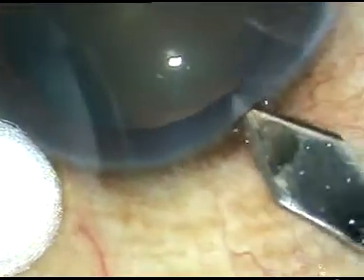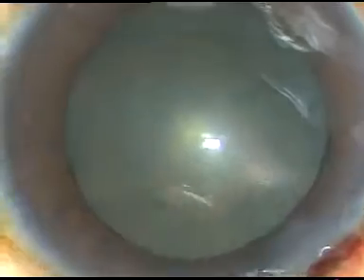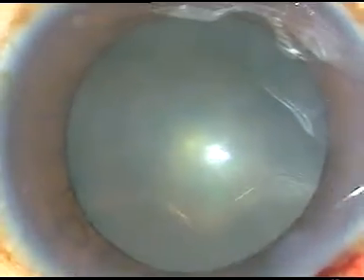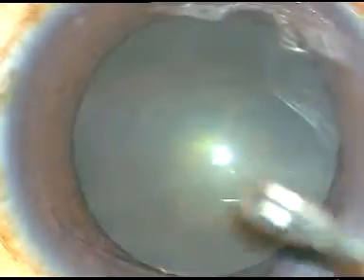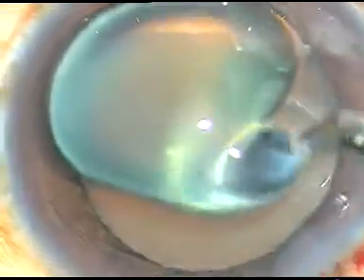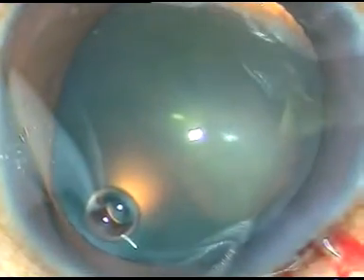Dear colleagues, in this video I am going to demonstrate my lens tilt technique. By this time the main incision has been placed. Viscoelastic substance is injected into the anterior chamber and it is sprayed over the epithelial surface of the cornea for better visibility and to protect the ocular surface.